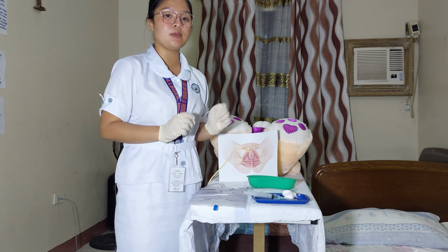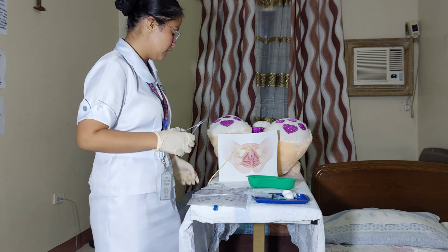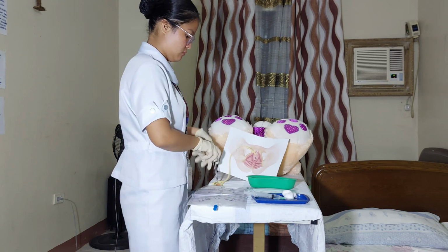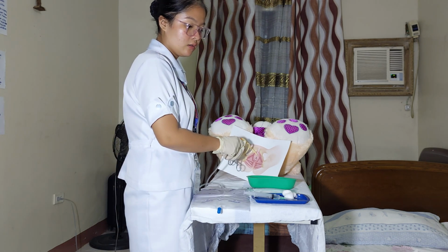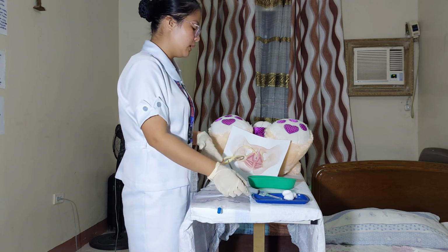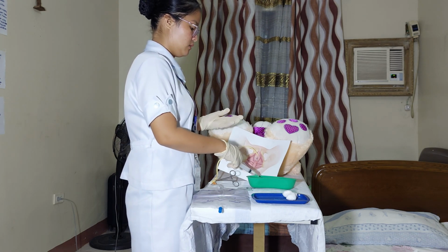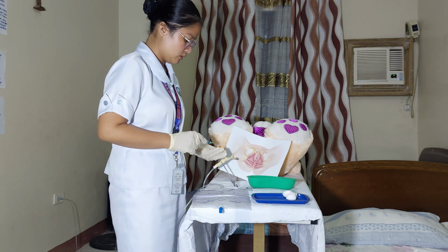So the first step, after wearing your gloves, is we need to clamp the urinary catheter so that it doesn't spill when we open it. So I'm going to clamp the urinary catheter, so that when I open it, it won't flow continuously. So I'm going to deflate the balloon using the syringe.